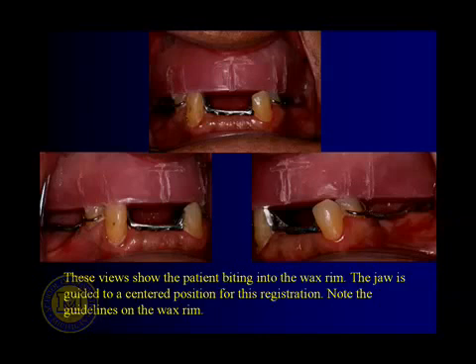In the back, it may be too little for you to see. The whole idea is that their chin moves away from my thumb by about 1/8 of an inch, give or take. Can you see that's accomplishing the same thing? I'm trying to get this distance of about 1/8 of an inch difference between physiologic rest and contact vertical dimension. Whether you get it with a ruler or a Boley gauge or a set of dividers or by holding your thumb by their chin and asking them to close, I could care less.